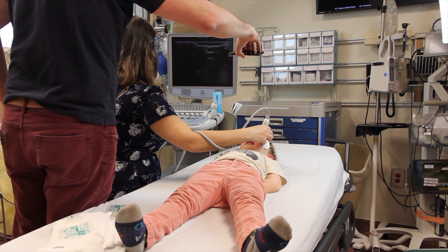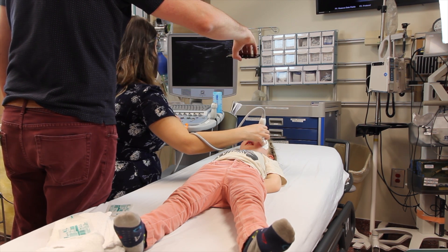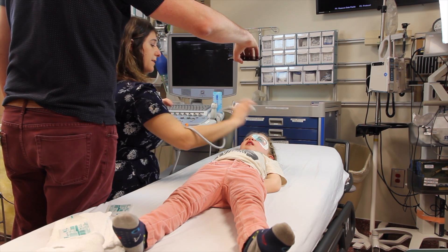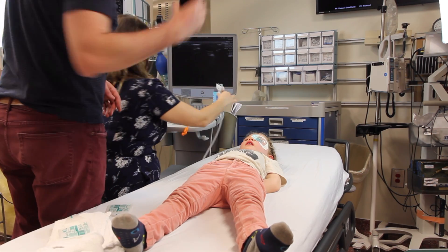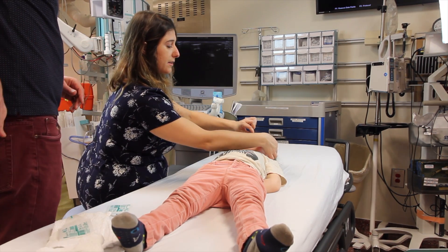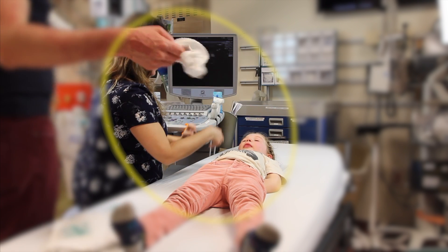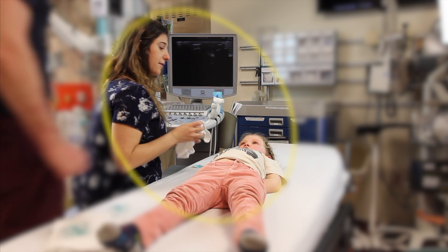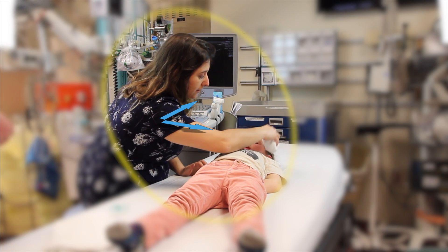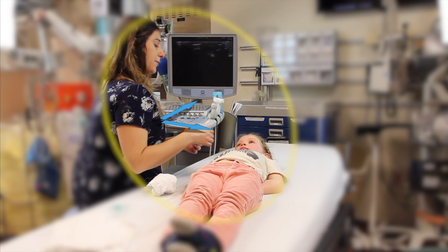As with all pediatric exams, the overall approach begins when you enter the room. It may be frightening to a young child to see a large machine enter the room. Position the machine so that the child can see it, but it's not right beside the bed or the child. After your history and physical exam are complete, move the machine beside the child. Ensure the machine is positioned to optimize your comfort and scanning ability, with the machine and the child in the same eyeline so you can watch the screen, touch the buttons, and examine the child comfortably.